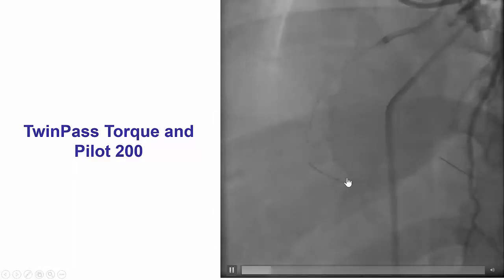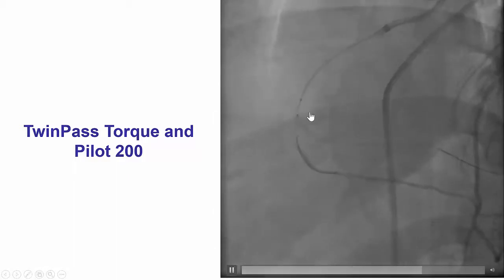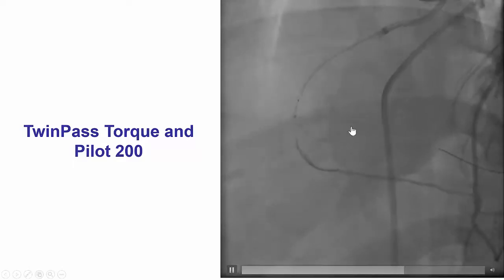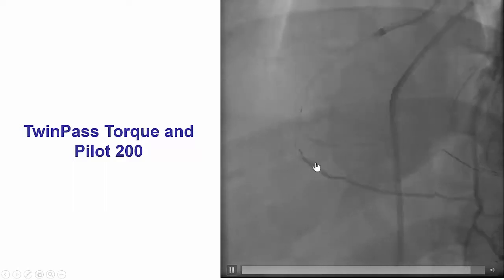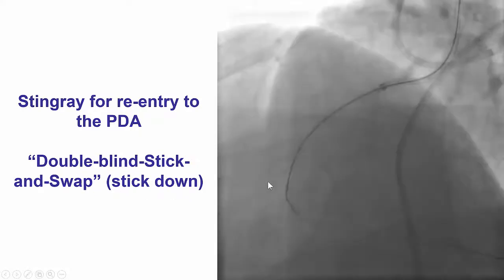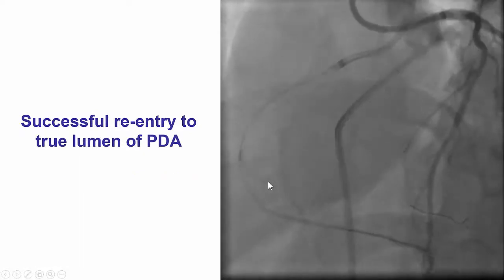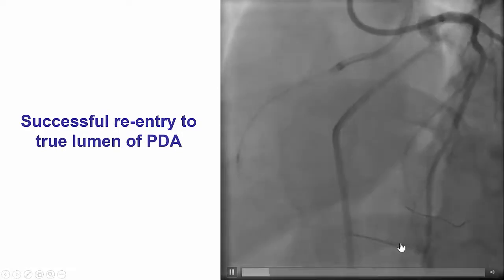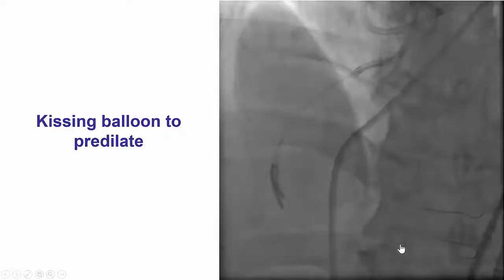To re-enter into the PDA, we used a Twin Pass Torque microcatheter, which is a very torqueable dual lumen microcatheter. We were able to advance a Pilot 200 wire subintimally into the PDA. We used a Stingray to re-enter, and once again, the double blind stick and swap technique — sticking on both sides of the Stingray balloon. Much easier than the posterolateral, we were able to advance a Pilot 200 all the way into the PDA.